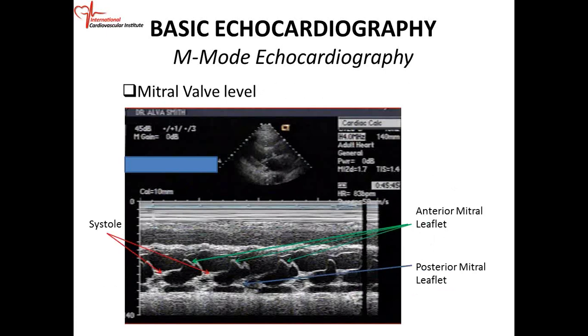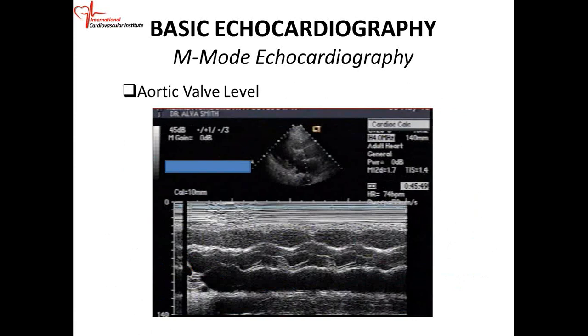For the left atrial measurement, you essentially find out where the left atrium is largest. So it's probably right here, okay? It should correspond to systole, at the end of the T wave. So you drop from right there down to the posterior wall. That's the left atrial measurement. So you do 4 measurements at the onset of the QRS, and I'm pretty sure those are the ones they're going to put on the exam: septal measurement, LV dimension in diastole, posterior wall, and the aortic root.